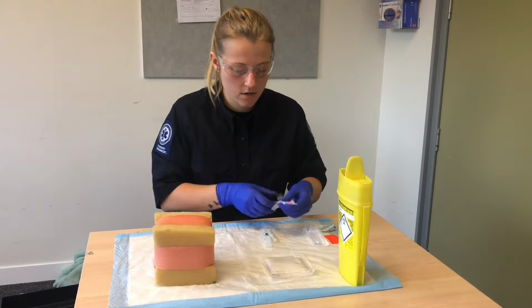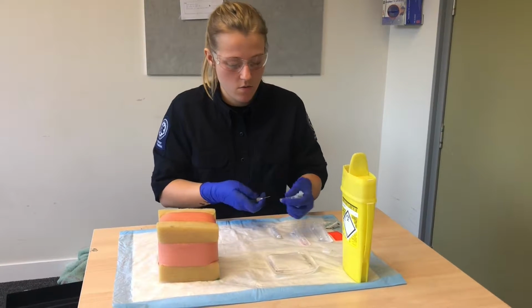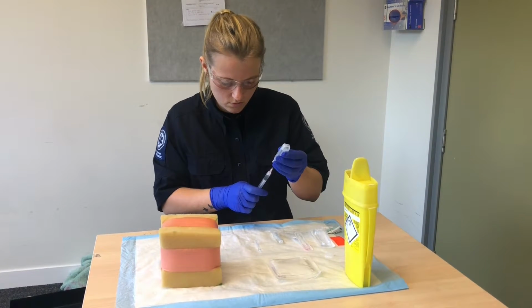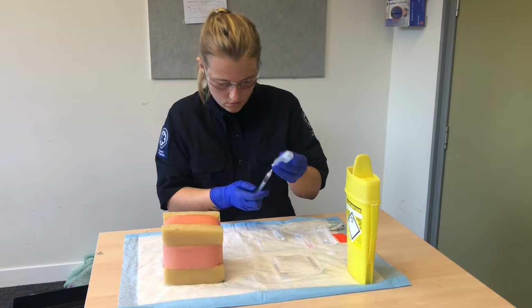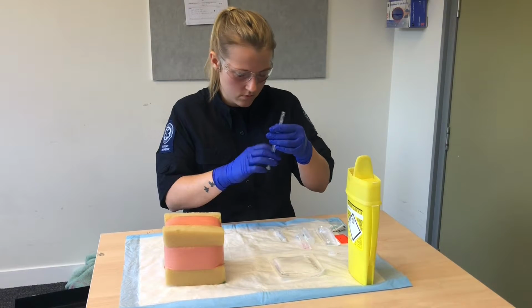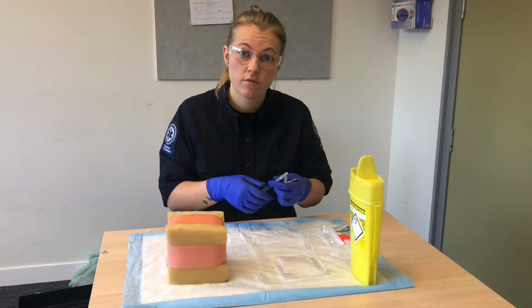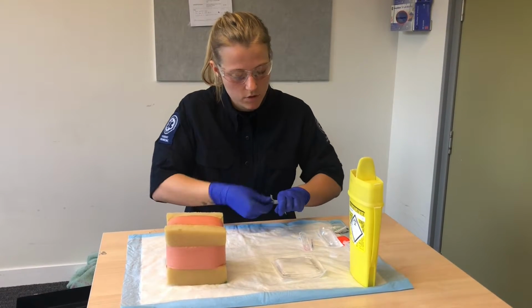So I'm just going to attach that and open my lignocaine. I just want to draw up 1 ml of lignocaine. Cool. I'm just going to recap the sharps, the blunt needle. And I'm using a 27 gauge sharps needle, but you can use 25 or smaller. And so just remove my blunt needle and attach my sharps.